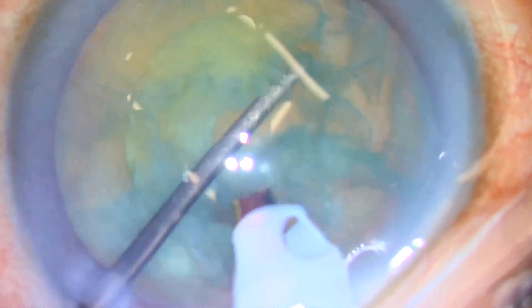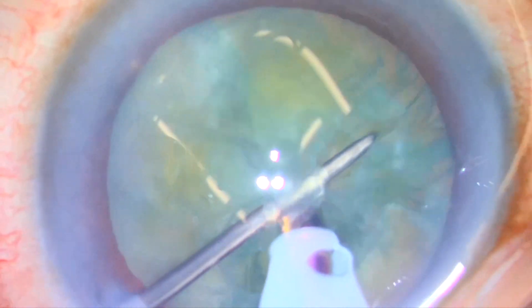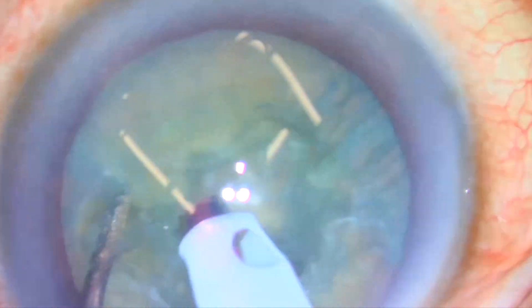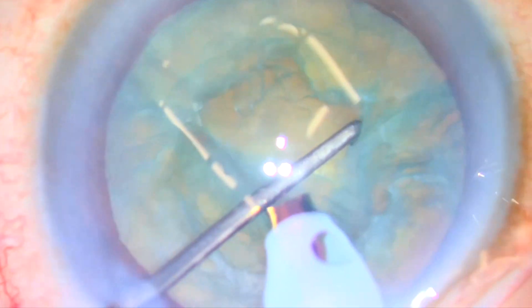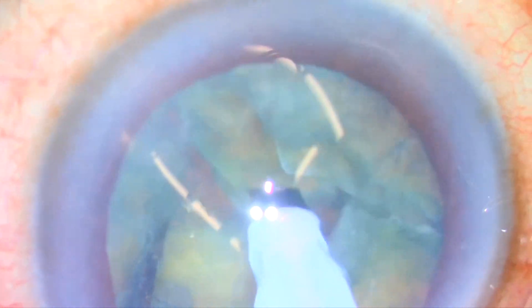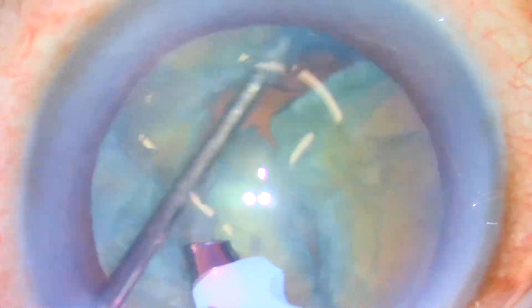It's up to the surgeon to: number one, prevent them from occurring; number two, knowing that they will occur, minimize the likelihood and frequency of a PC break; and number three, know how to manage them when they do occur.